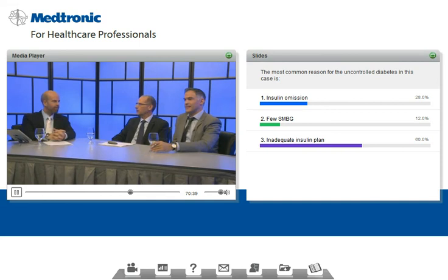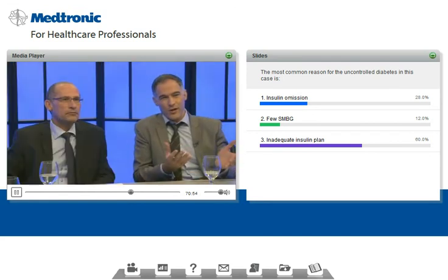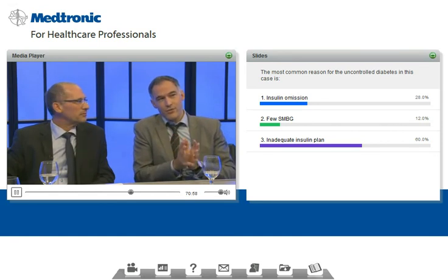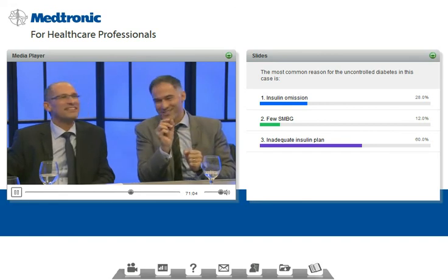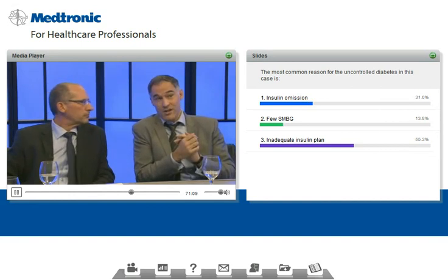So there we have our results of the first poll question. So Bruce, are you surprised at the results of the polling question? No, I'm not. I like the wording of inadequate insulin plan. That's what most people thought. So I'm not surprised. Now, if you said there were a few capillary measures, you would have had to have eagle-eye vision to see the average daily checks on your screen.